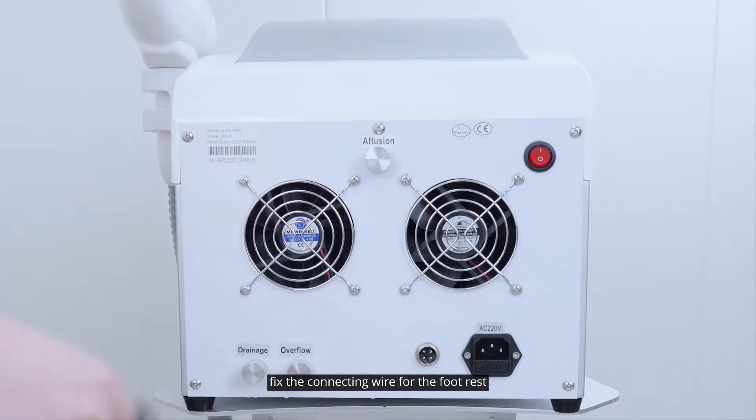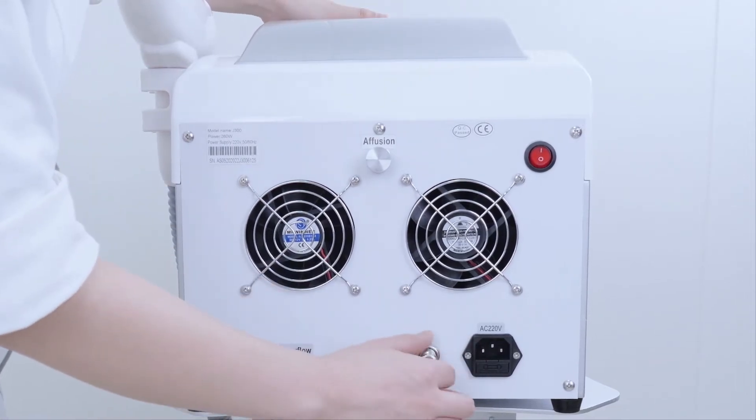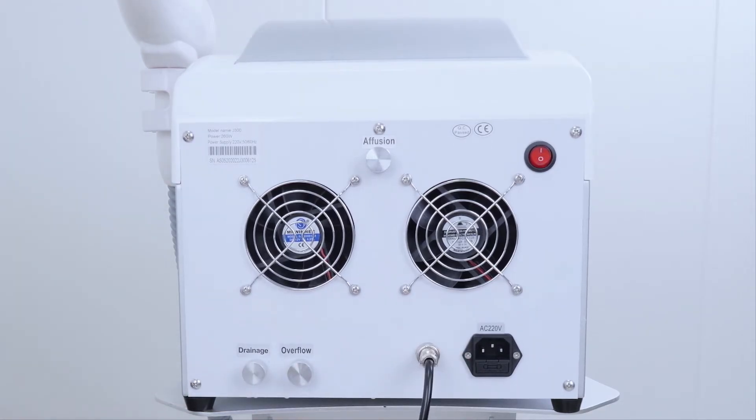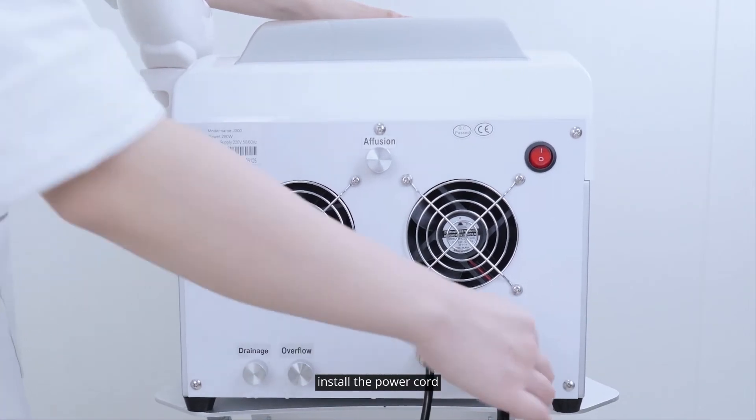Fix the connecting wire for the footrest. Install the power cord.